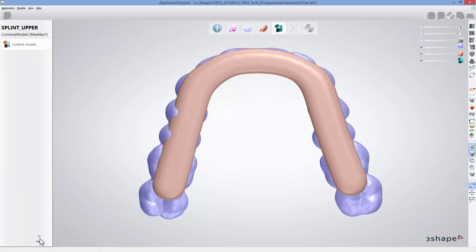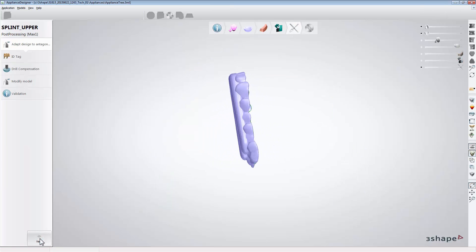When you click next you will get to the combine model step where the bar and the splint will be merged together. Click next to combine them.